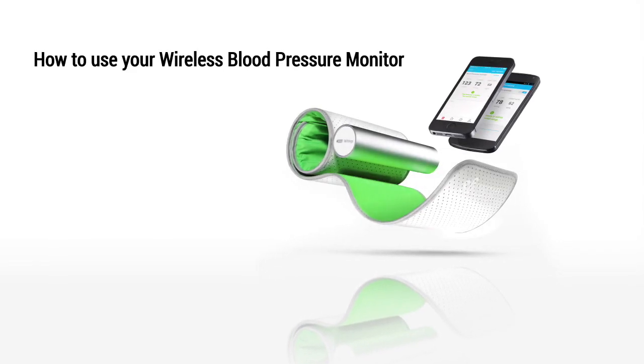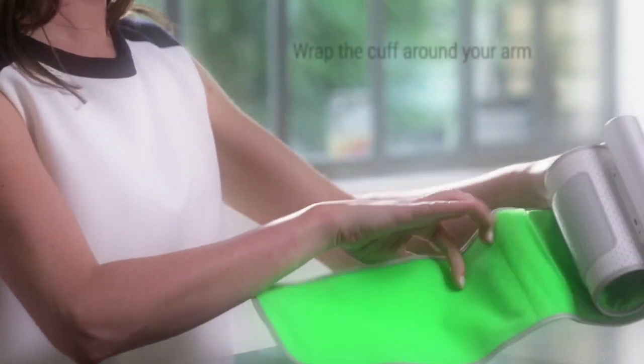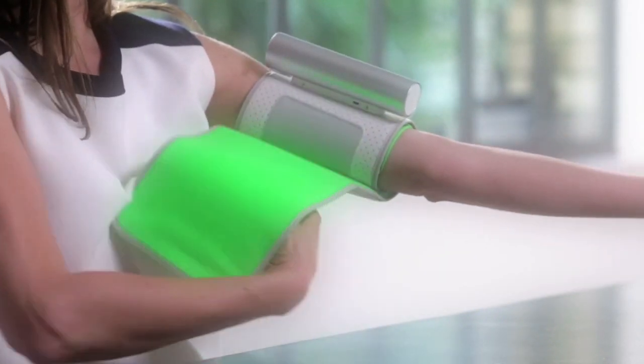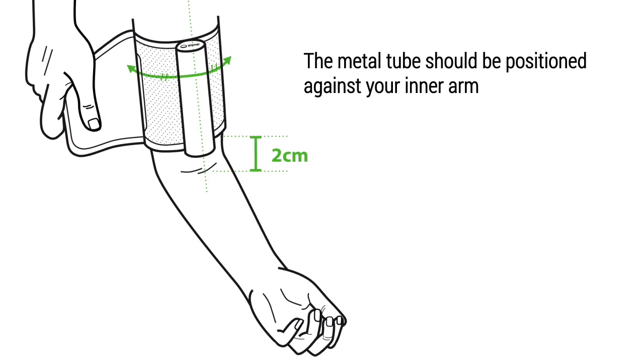Discover how to use your wireless blood pressure monitor. Place the wireless blood pressure monitor. The metal tube should be positioned against your inner arm.